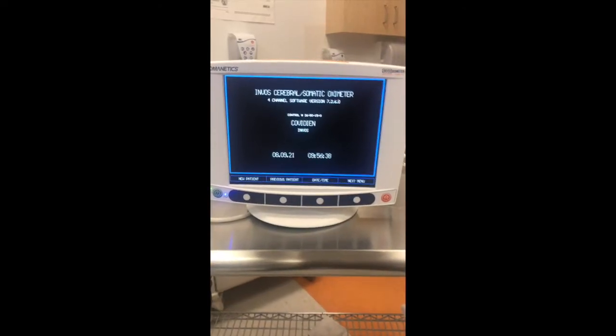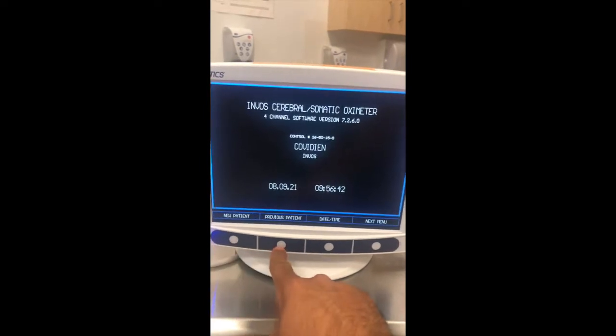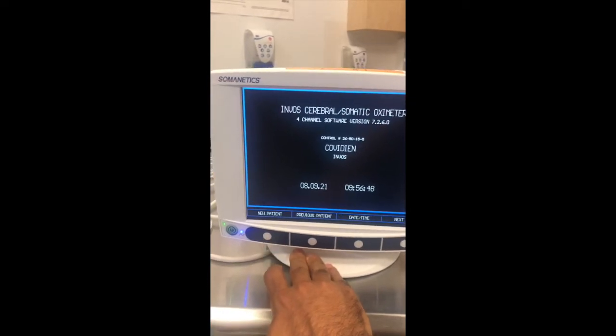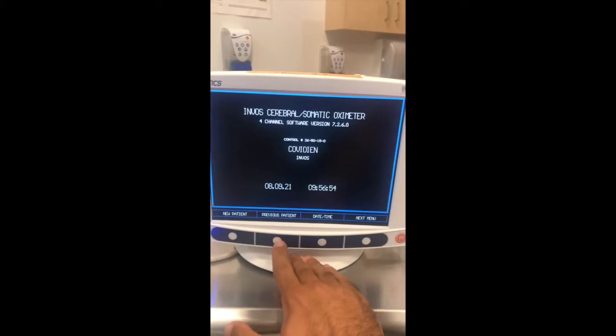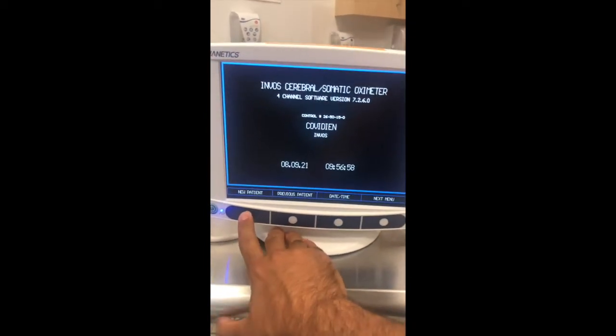Once the monitor is on, you can see different options: new patient, previous patient, date/time, next menu. Typically we would start with new patient. If you have unplugged or closed down your monitor and restart it with the same patient, you could just select previous patient and it would restart recording right away. But here we will create a new patient.